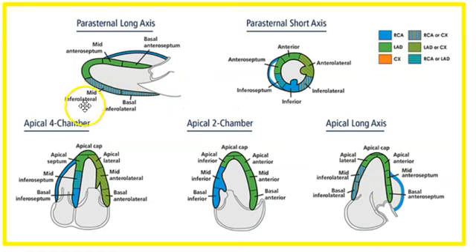You have your mid-infralateral, basal infralateral, and you also have the apical lateral. And here you could actually cut that down into the apical lateral up here too. Usually you just can't see it quite so well in this view, the apex part. You can see all the other walls. These walls are the same walls as they are down here.